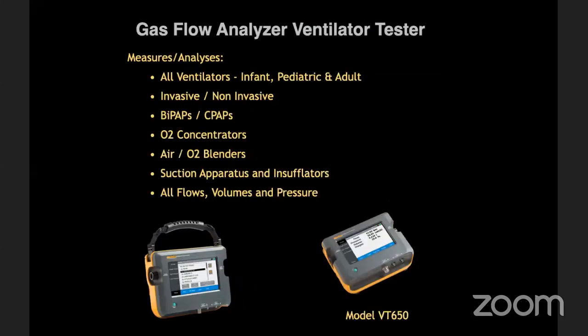Gas flow analyzer, otherwise called ventilator tester. This will check the performance of all the ventilators, invasive, non-invasive, BiPAPs, CPAPs, O2 concentrators, air oxygen blenders, suction apparatus, insufflators, and all flows, volumes, and pressures. Anything related to flow, volume, pressure, you can check, the positive and also the negative pressure.